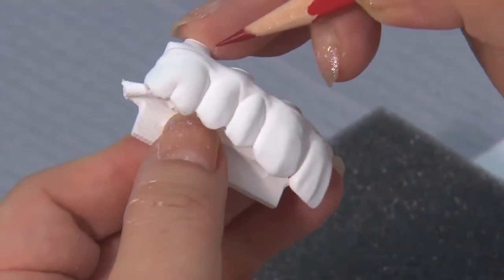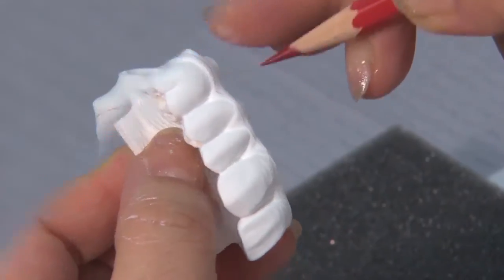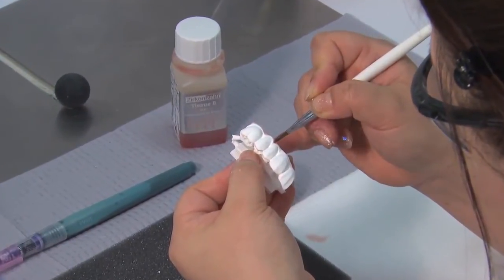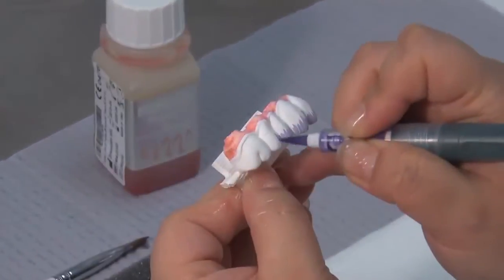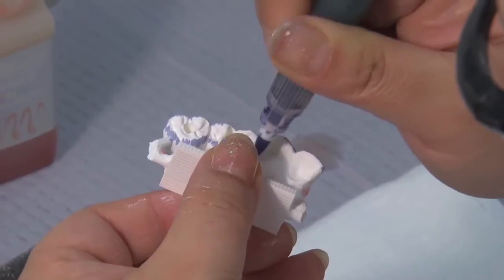Before applying stain, a red pencil is used to define the gingival margins on both the facial and lingual surfaces. For preliminary staining of the prosthesis, three to five unique stains are applied to pattern the gingival areas, incisal edges, and occlusal surfaces.